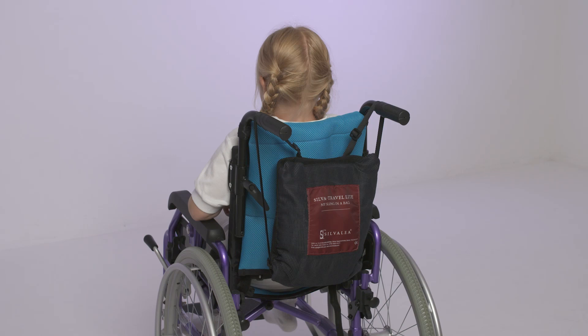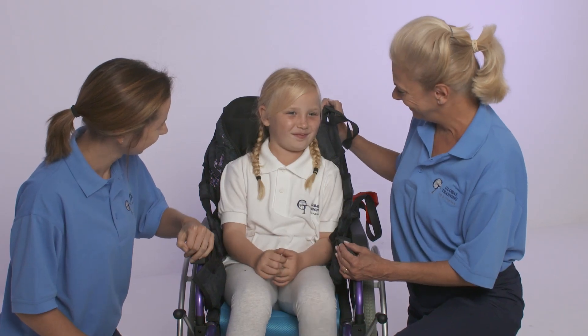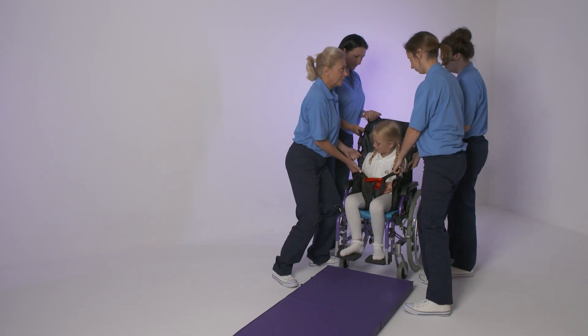The sling is a practical way to make travel and leisure opportunities more accessible for all, particularly where manual transfers are likely to be the only option.